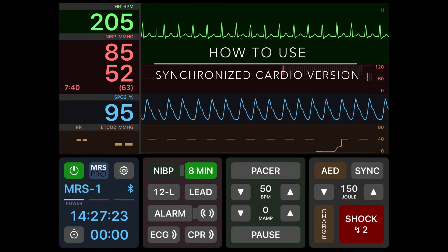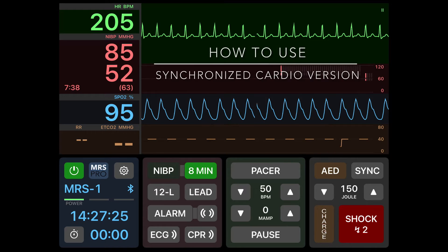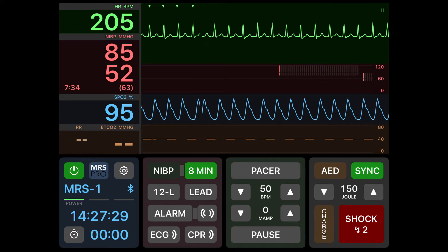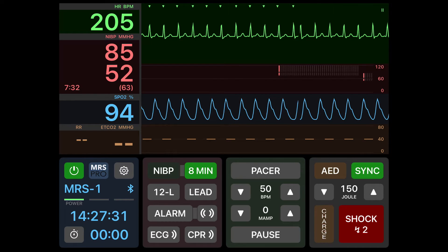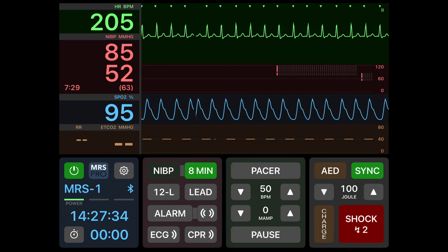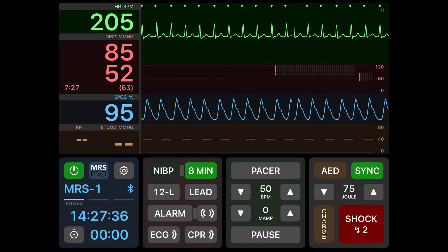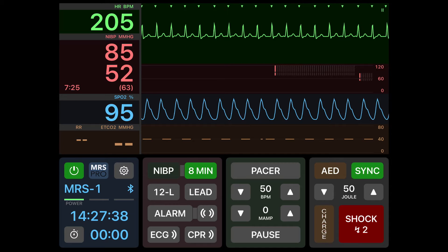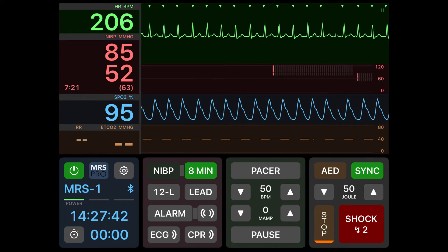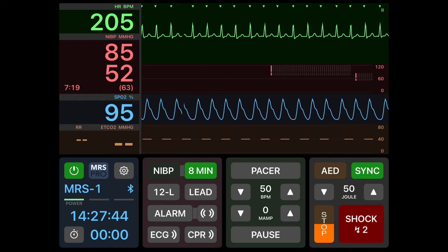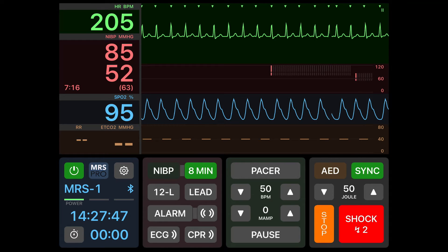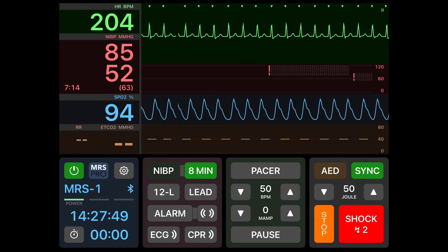Next let's look at how to use synchronized cardioversion. To cardiovert, push the sync button. You'll see that above all of the R waves an arrow marker is there. Adjust your energy selection to the right dose and push your charge button. If a mistake is made you can also hit stop. Once you have your charge ready, push and hold for cardioversion.